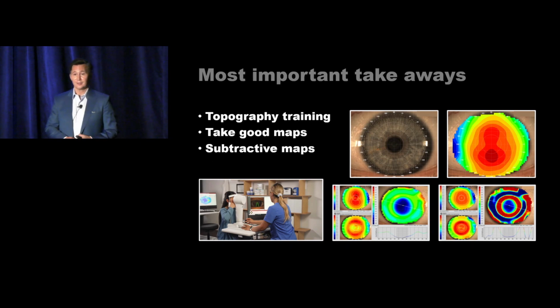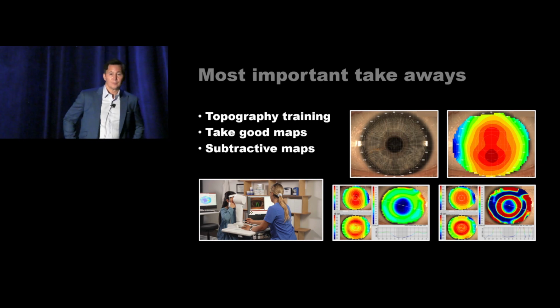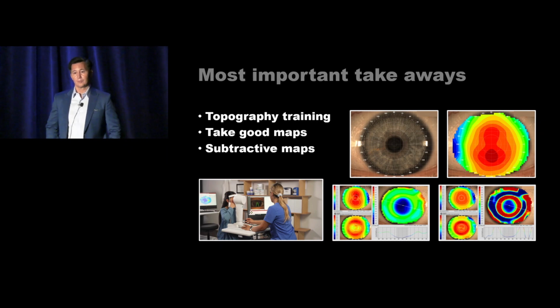Yeah, quick question? With the axial map, would you use that if you were to do a level fee structure? Like, I'm not going to do 6 levels, but I'm going to do 3 levels, and dependent upon the actual map, that's what I'm going to charge my fee? Yeah, I think that's a great idea. So the question is, can you look at the axial topography and have it guide your decision-making on fees? And yeah, if it's a symmetric eye, if it's a spherical eye, if it's an apical astigmatism, I'm thinking easy case. If it's limbus to limbus, I'm going to jack that up.